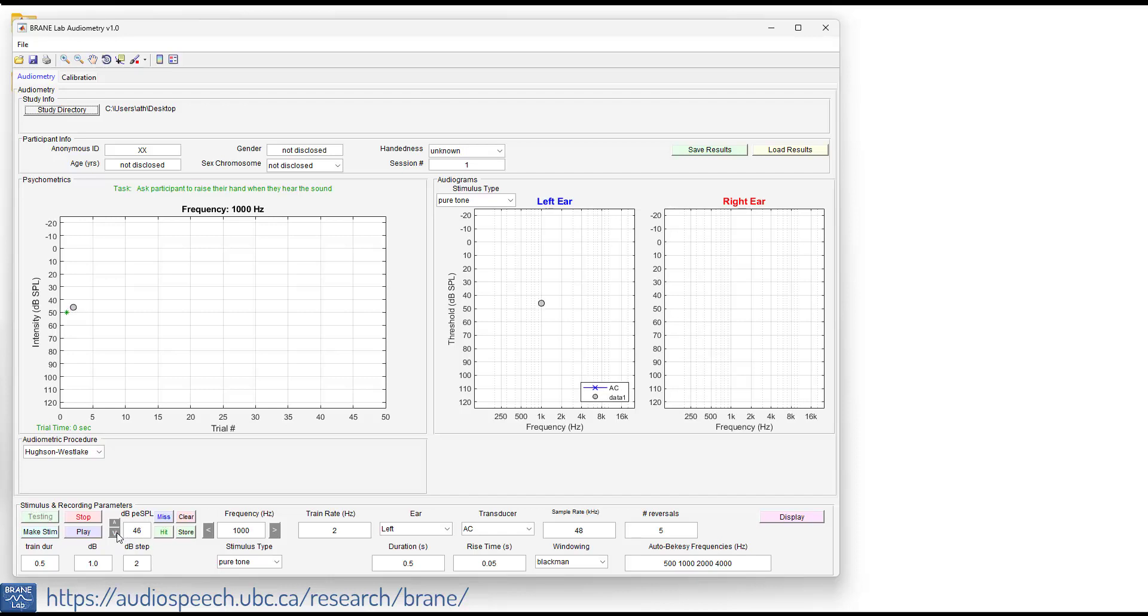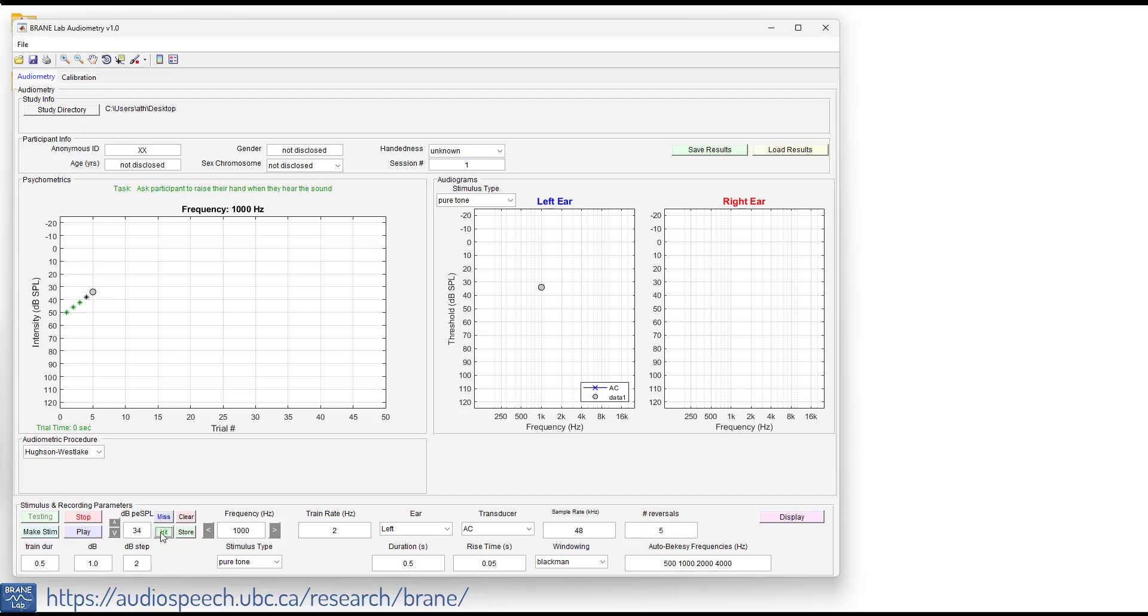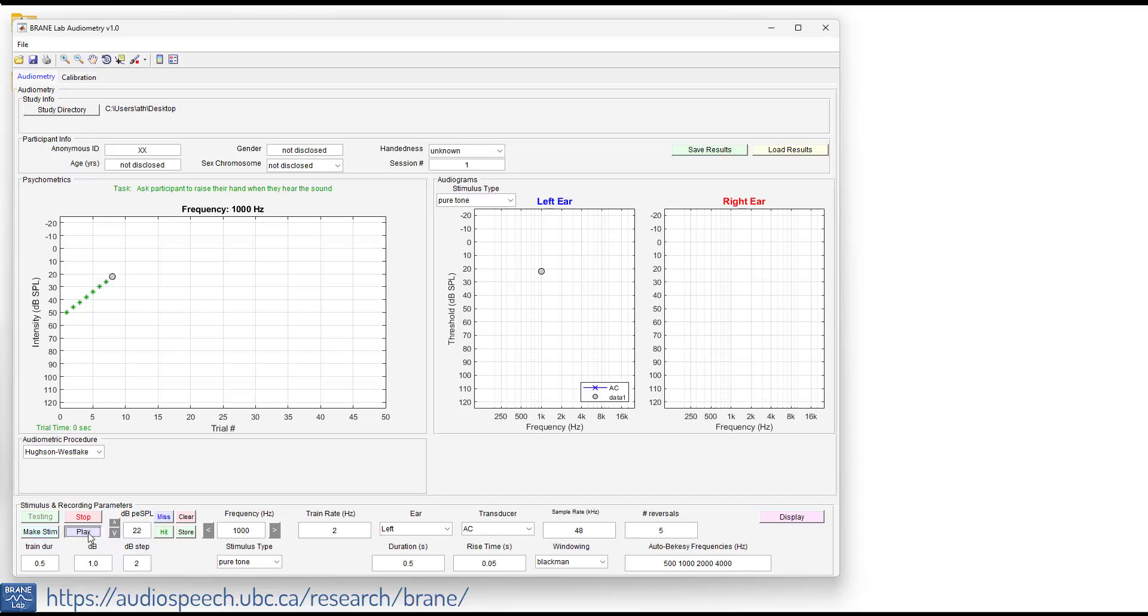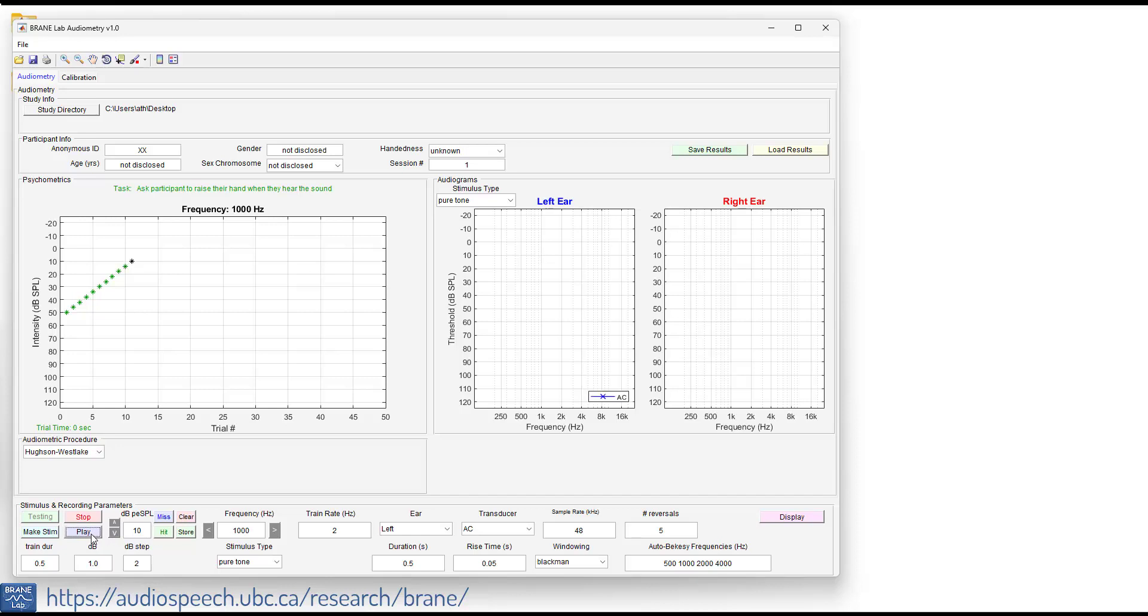In this case, normally clinical assessments is going to be going down 10 dB up five, but we're using two dB steps here. So we're going to go down by two, press play. That's another hit. Another hit. Still heard that. Down two. I did not hear that one. So I'm going to put that as a miss.